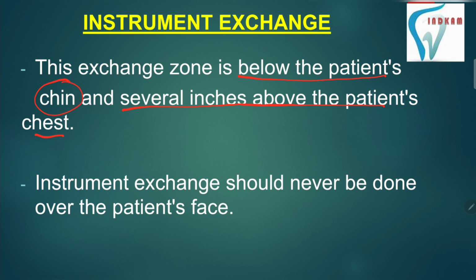Instrument exchange should never be done over the patient's face. This should be marked that it should never be done over the patient's face. It is very irritating for the patient also, uncomfortable also, and there might be some chances if any instrument will slip, it will fall off on the face of the patient, which is also very embarrassing situation for an operator.